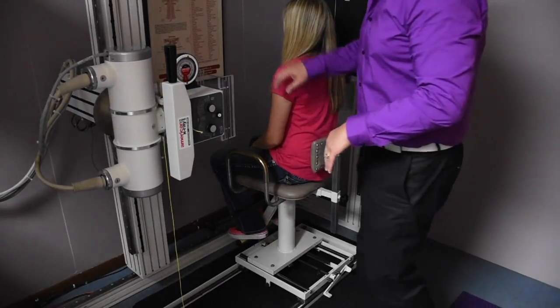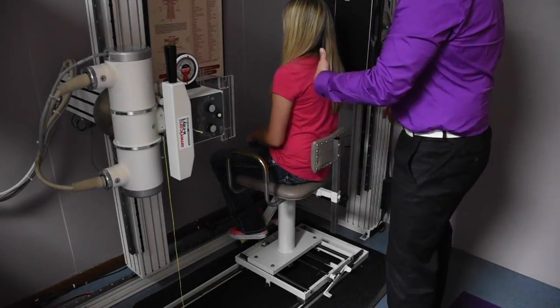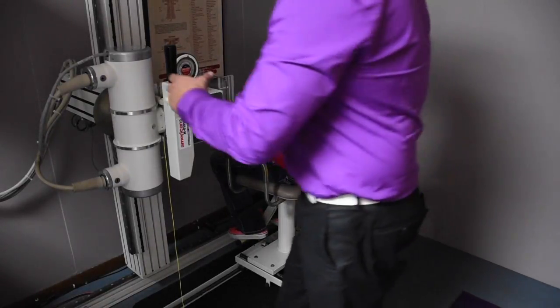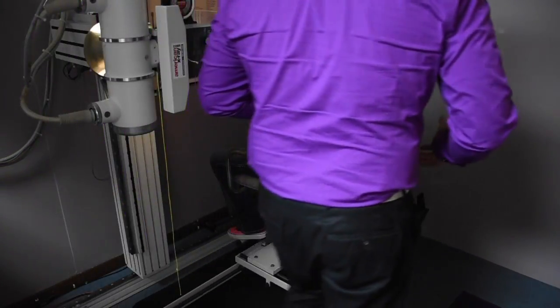So what we're going to do is if the patient has longer hair like this, instruct the patient to go ahead and move your hair back behind your shoulder if you could please. There we go. So we have good access to the side of the neck. Then we're going to move the tube up.